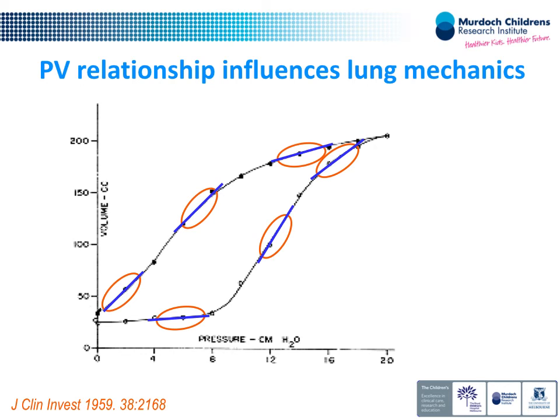Preterm, but it's early lung disease. No, but it's the concept. Yeah, the concept's the same. The concept is the same with the older baby, although the practical approach and how you do it is slightly different. You may do it less frequently in a really sick MAS baby where you know the disease will take longer to change.